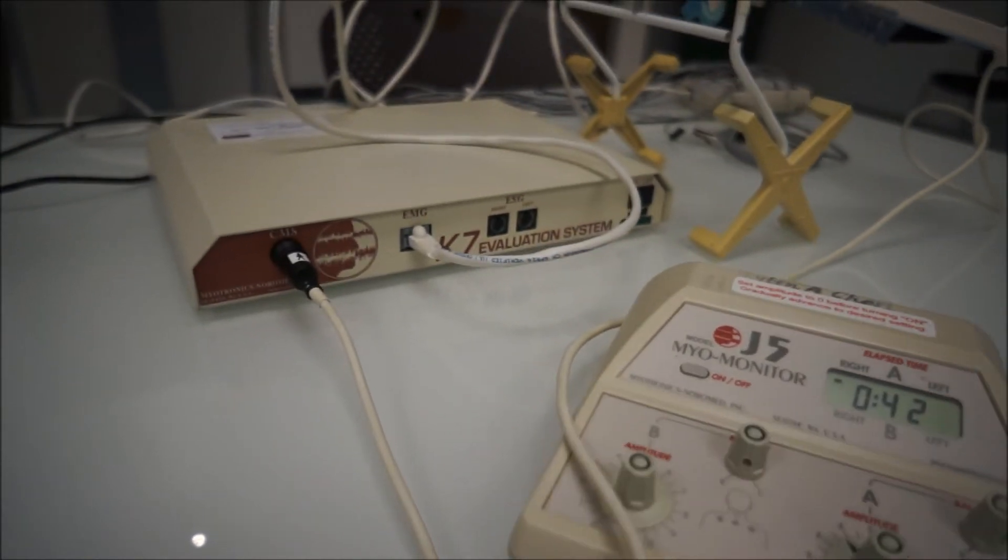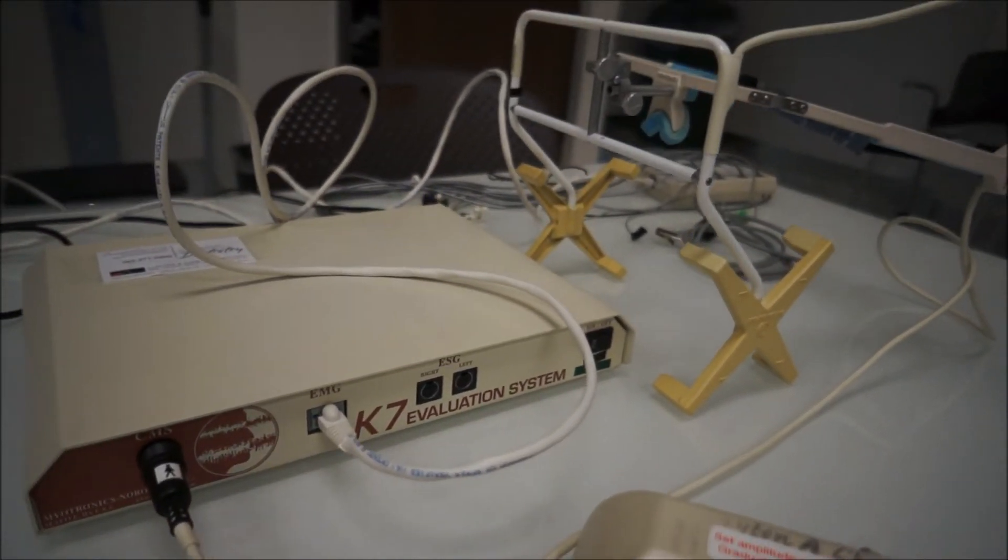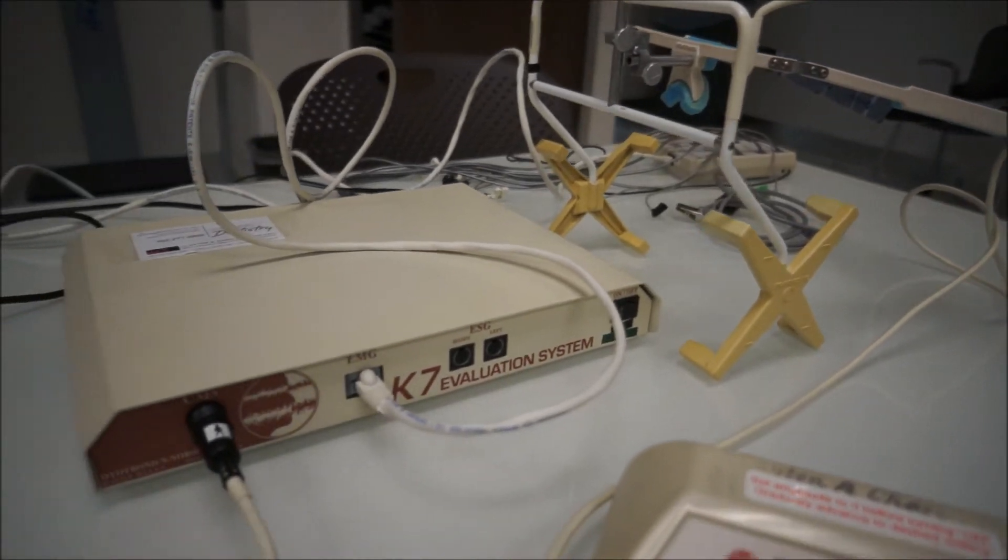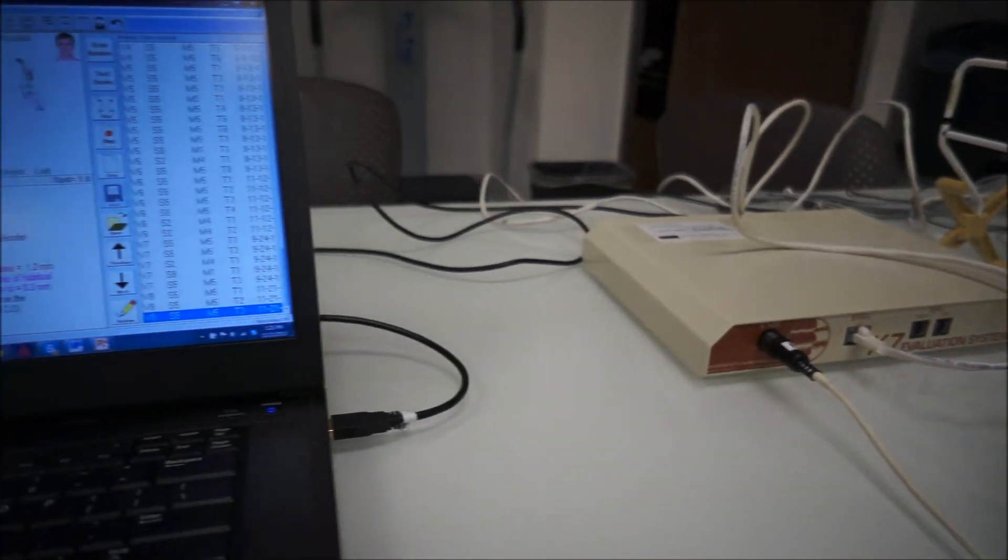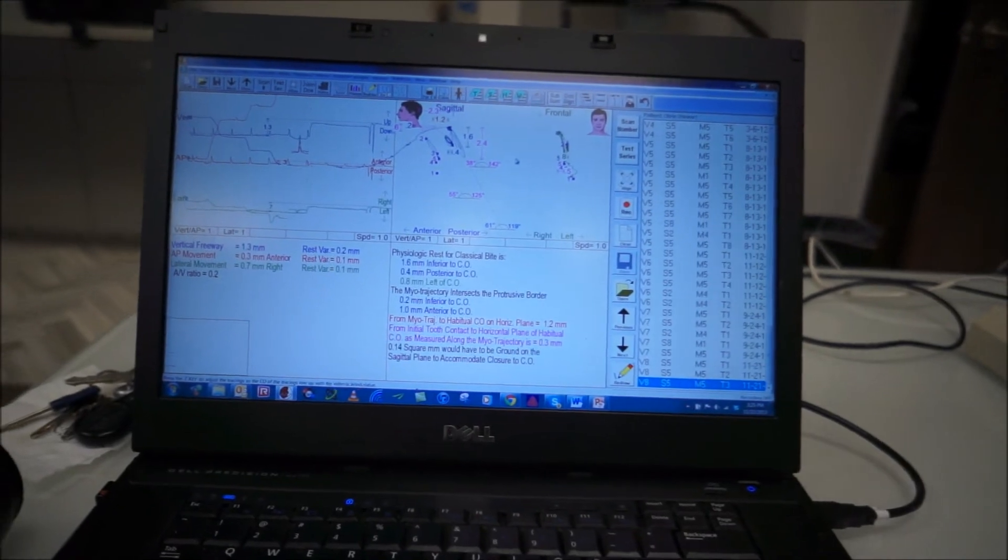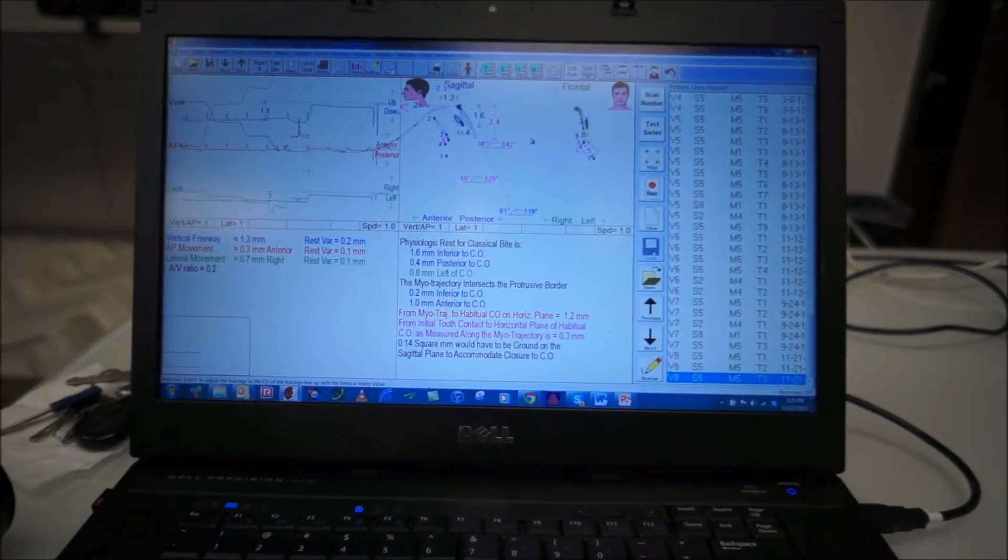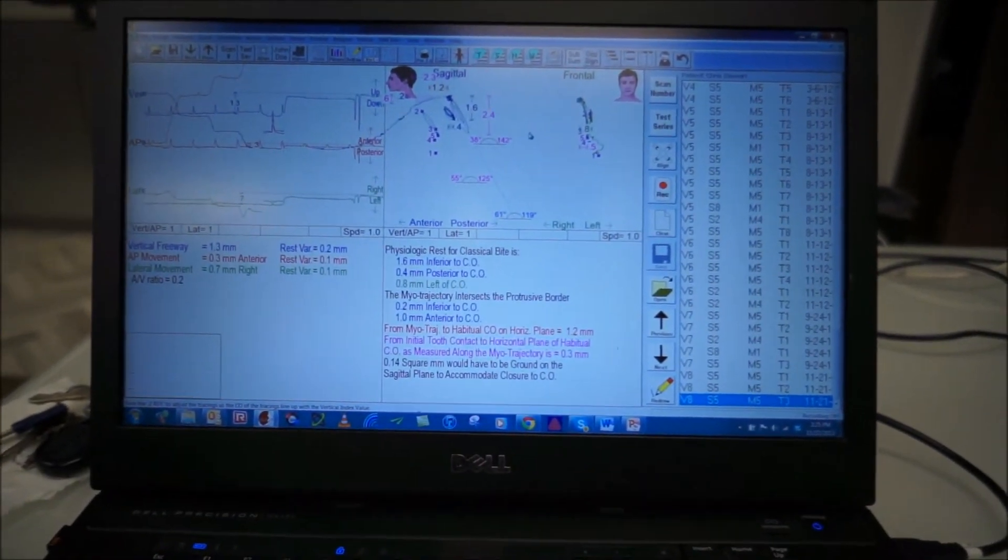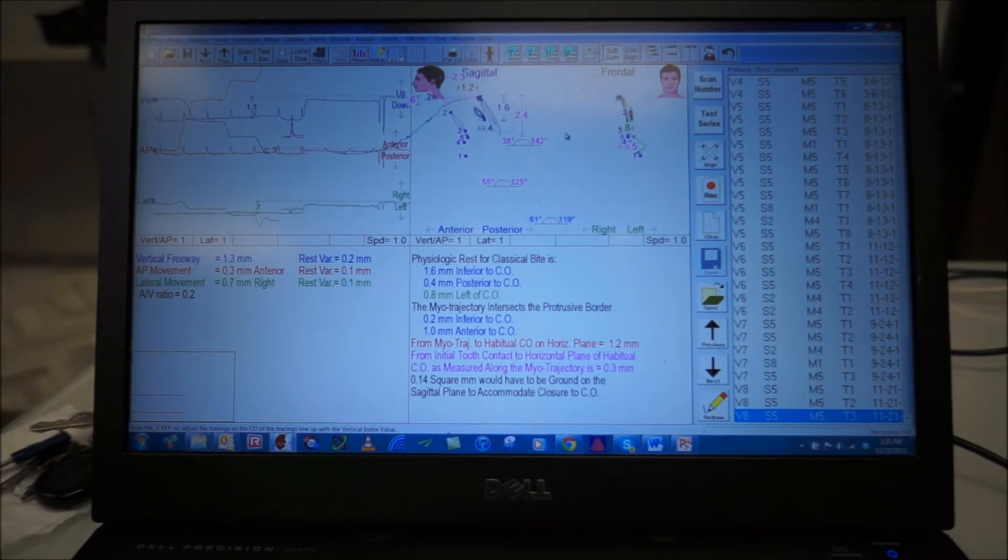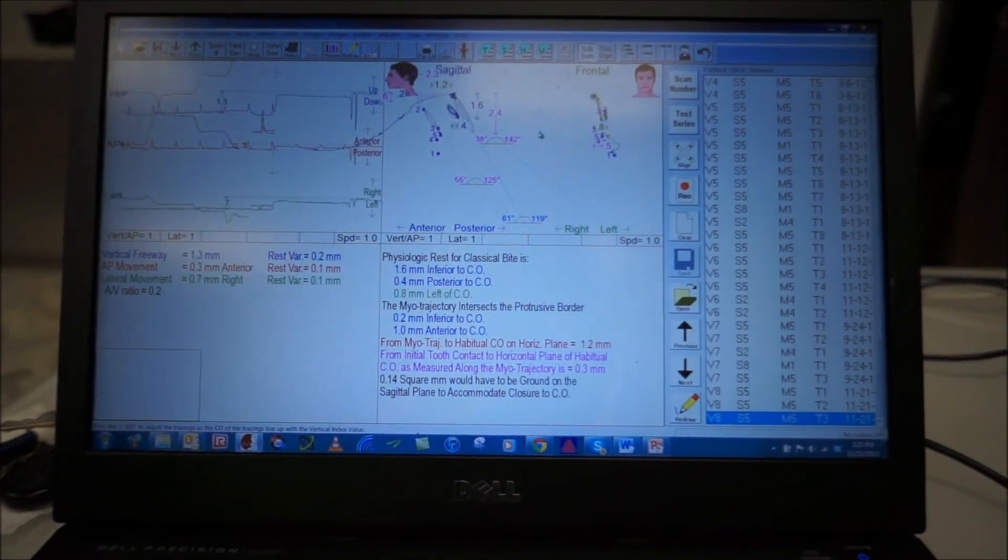And then we use the kinesiograph, the K7, which comes with the sensor array and then begins to hook to our computer to be able to then jaw track specifically location of our patient's bite position, specifically when they have joint derangement, muscle pain problems, and masticatory muscle dysfunction.